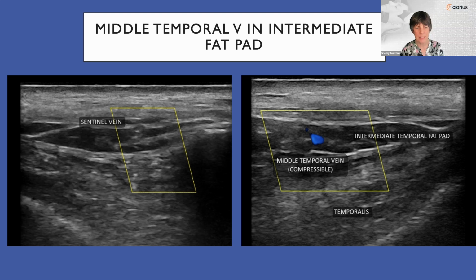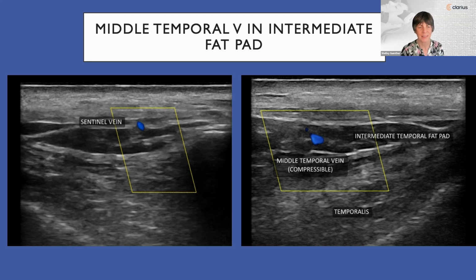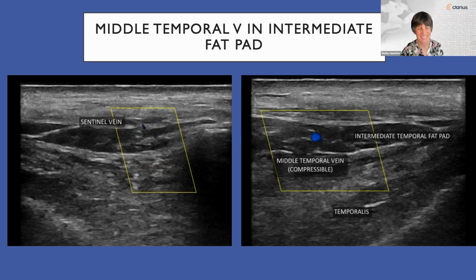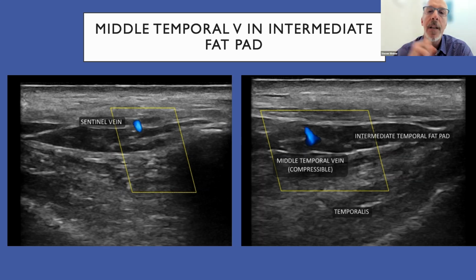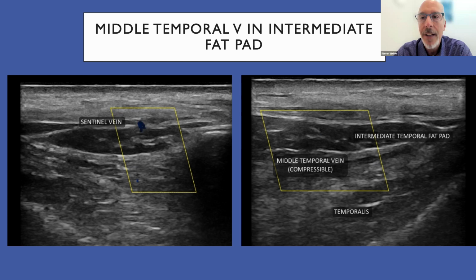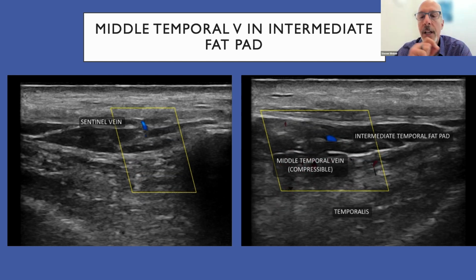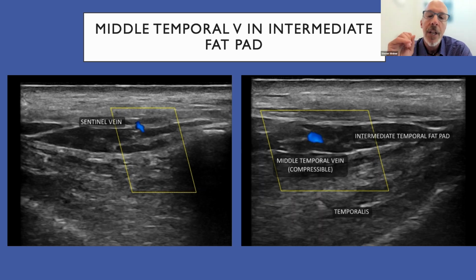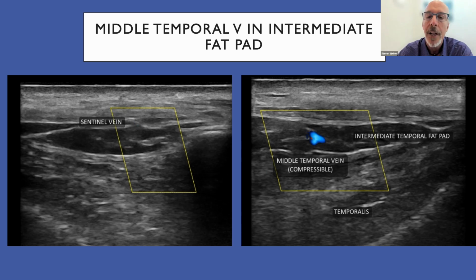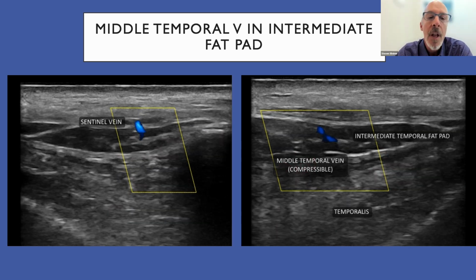Yeah, the power Doppler is so sensitive to any movement, right? Because it's looking for really low flow. So yeah, you can't have the patient talk during this. Right. And every little movement of the probe you might see some artifact. But you can determine artifact from real if the pulsation is constantly in the same area. If it's constantly in the same area, it's most likely not an artifact. It's most likely the artery.